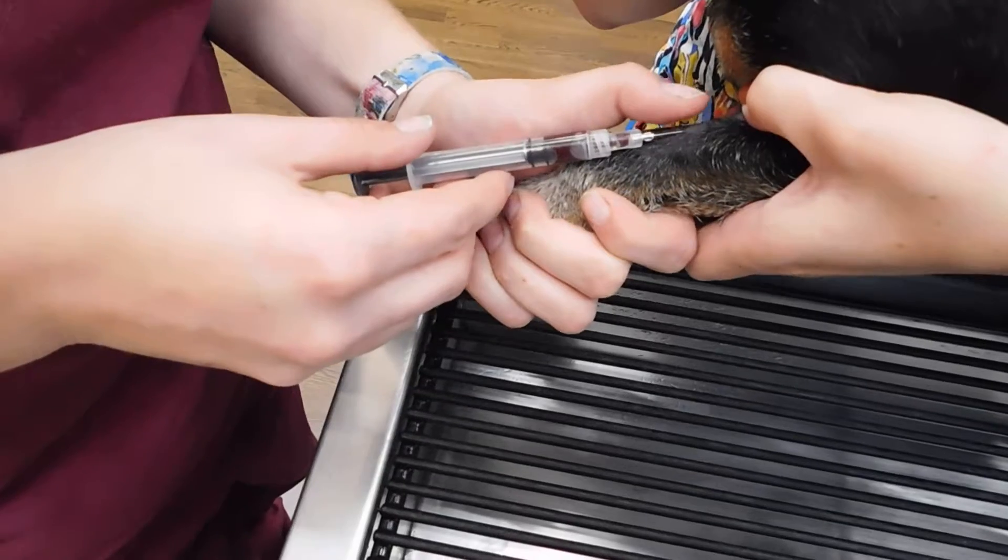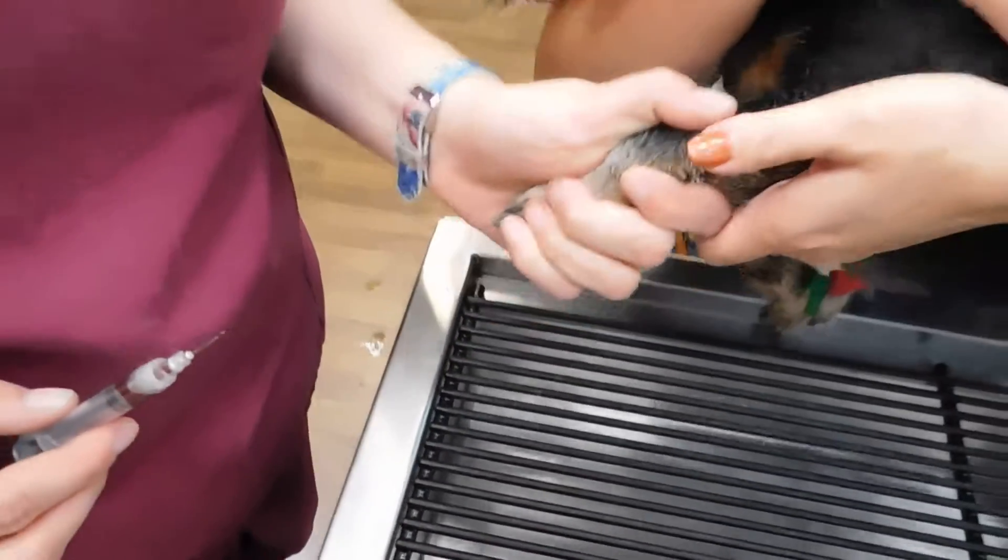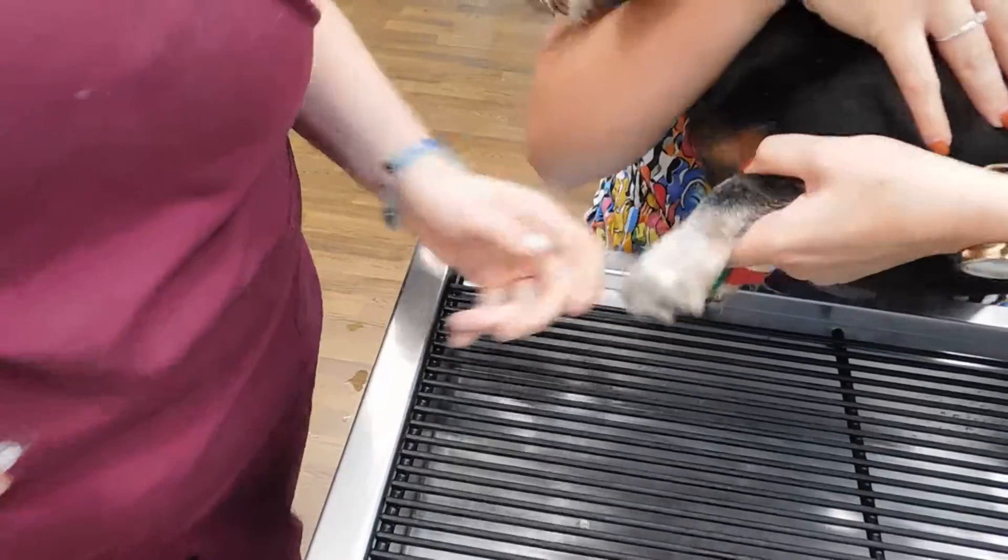Alright, and that's all I need for the sample. She's going to let up. I'm going to hold off after I pull my needle out, and she's going to continue to hold off to prevent any hematoma.